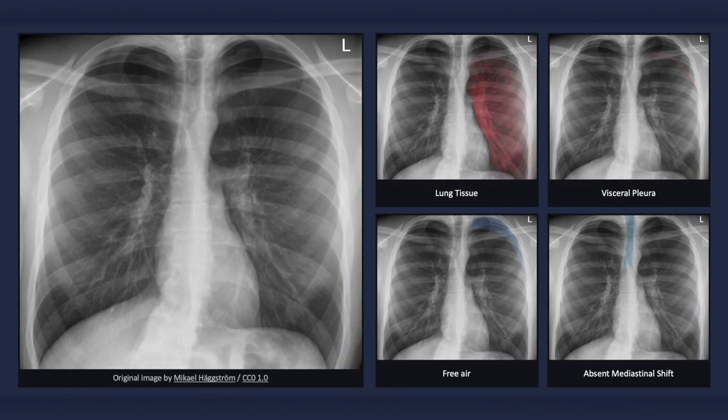To quickly recap, with a pneumothorax, a thin sharp white line — the visceral pleura — separates the lung and the free air, which is void of bronchovascular markings. In the case of a simple pneumothorax, there will not be any signs of mediastinal shift.